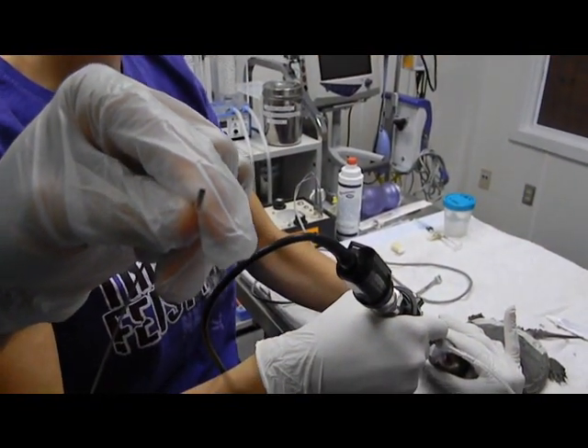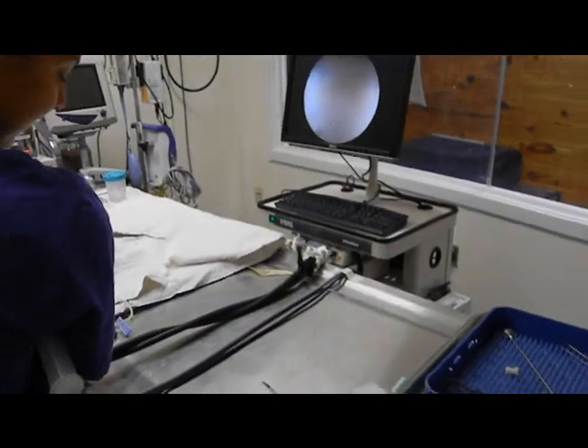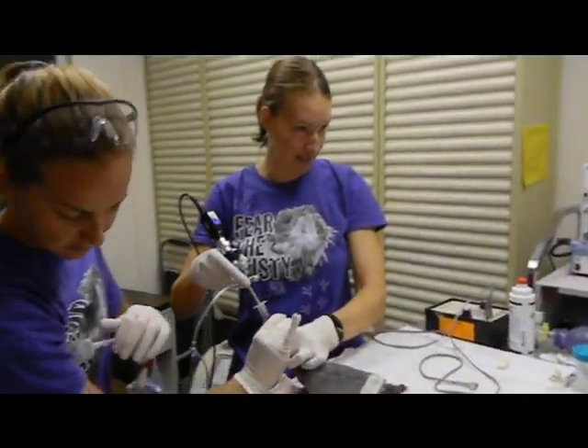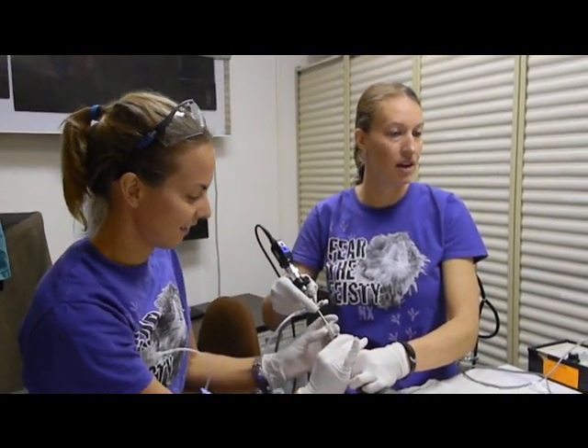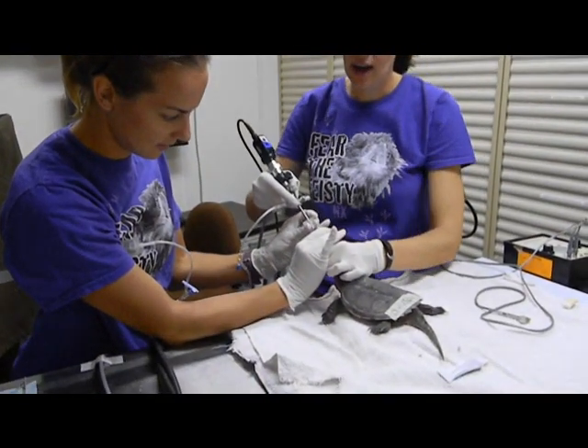I don't know if you can focus on that or not, but yeah, I have a little gauze right there that you can clean it off on, and then we'll just maybe try to get a couple more pieces, because that's fun, and then we'll be done. I think he'll swallow that enough. Okay, and then so, I don't know.